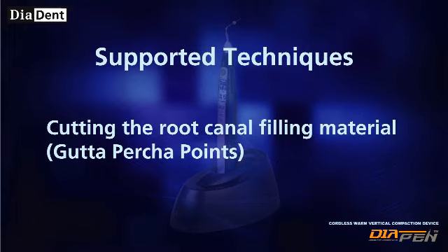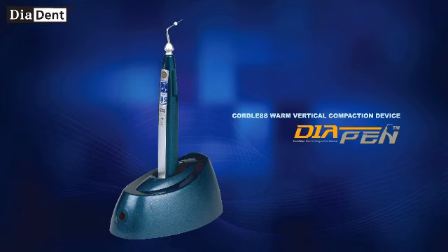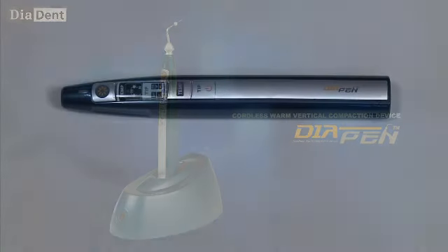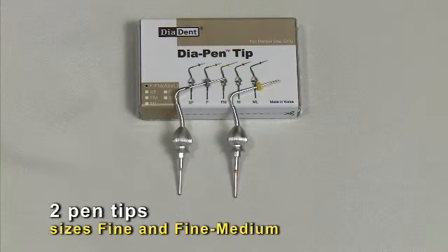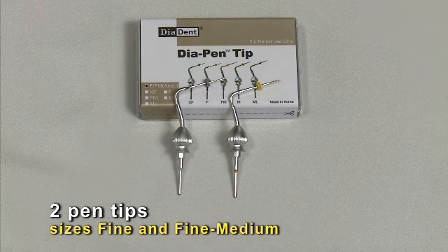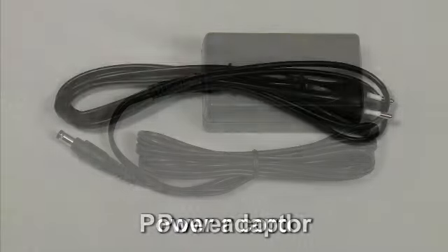Additional techniques include cutting the root canal filling material, and compacting the root canal filling material using heat. The Diapen kit includes a handpiece, a charger base, two pen tip sizes — fine and fine medium — two silicone covers, a power adapter, and a power cord.